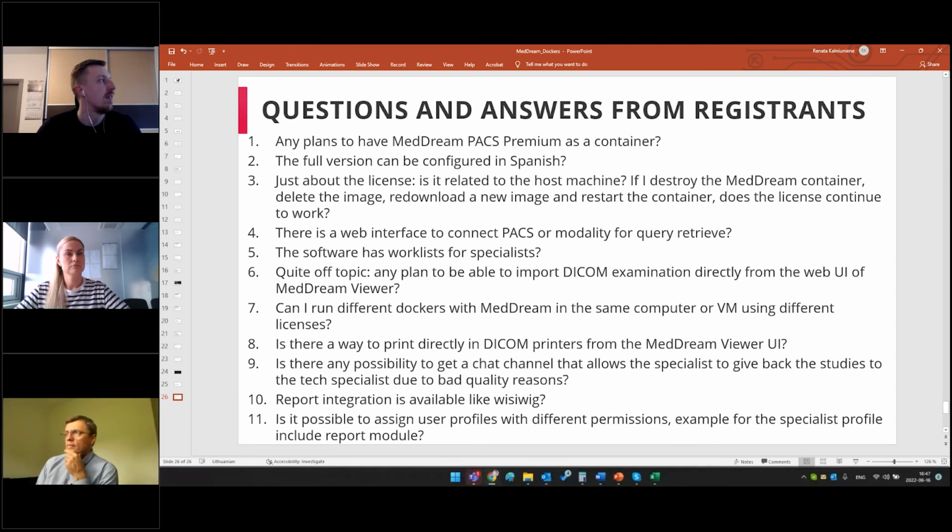But in any case, you would need to configure in the file. But we have an installation manual which describes it. We have samples of the configurations with each PACS, with the DICOM query, with examples. Also, you can contact us anytime, so we will help you to make a connection if you face some problems.